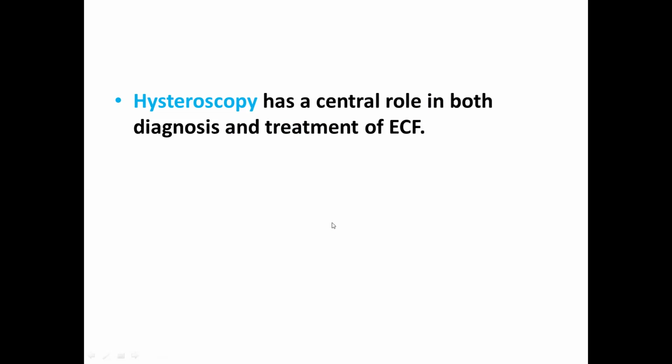So don't ignore the hysteroscopy. Don't ignore to offer your patient hysteroscopy to search for a cause, particularly chronic endometritis, hidden adhesions, or any minute or tiny lesions inside the endometrial cavity.